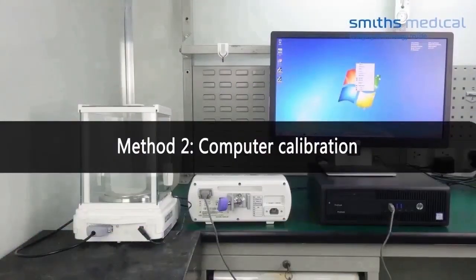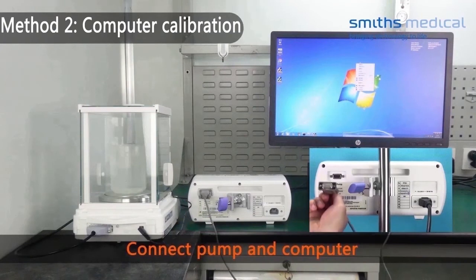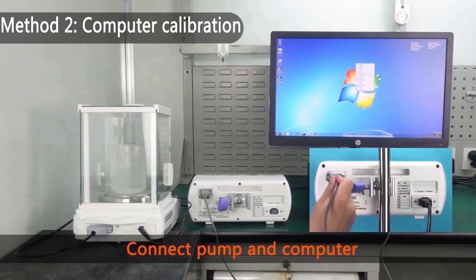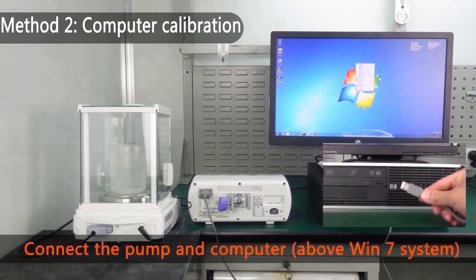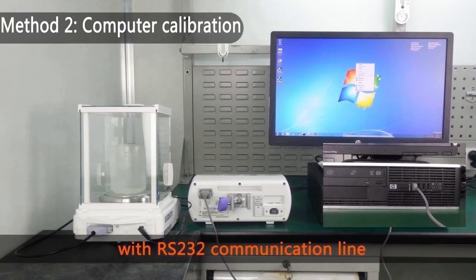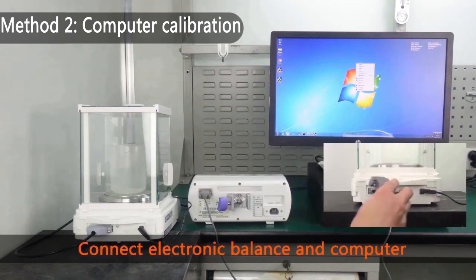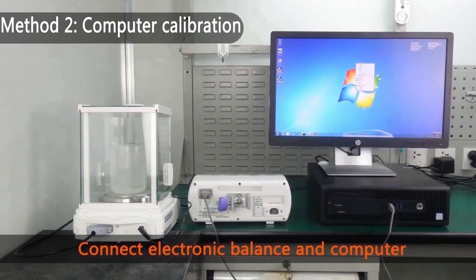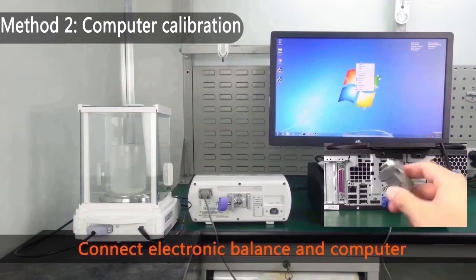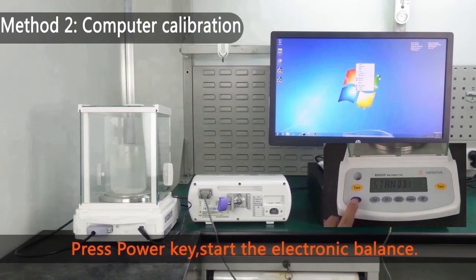Method 2: Computer Calibration. Connect the pump and computer using the RS232 communication line. Connect the electronic balance and computer.